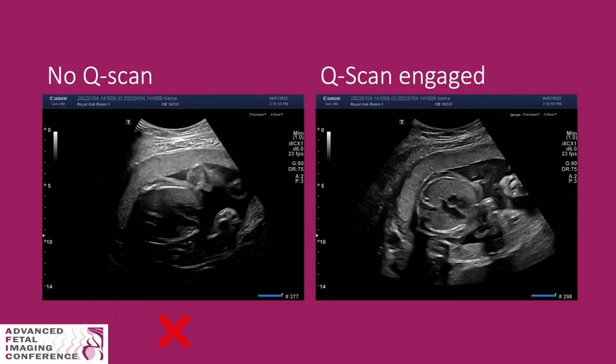Activating the Qscan should be an essential part of your daily scanning and will save you both time and frustration, and it will also allow you to spend more time on more advanced image optimization tools, as the ones I'm going to show you later in this presentation. It is crucial to allow Qscan to become a part of your everyday scanning practice.